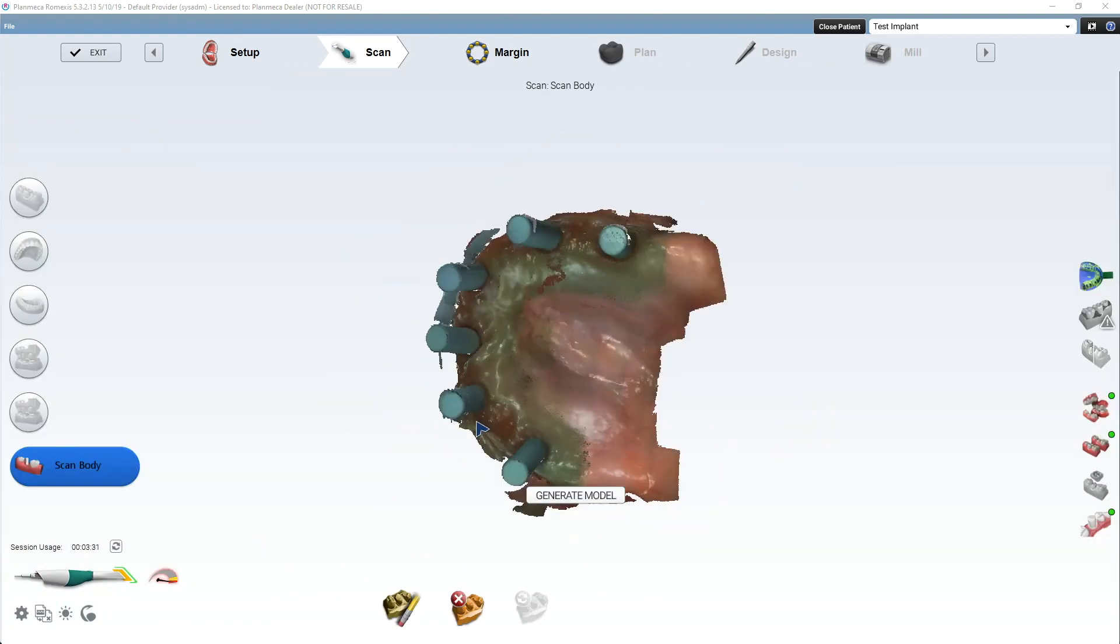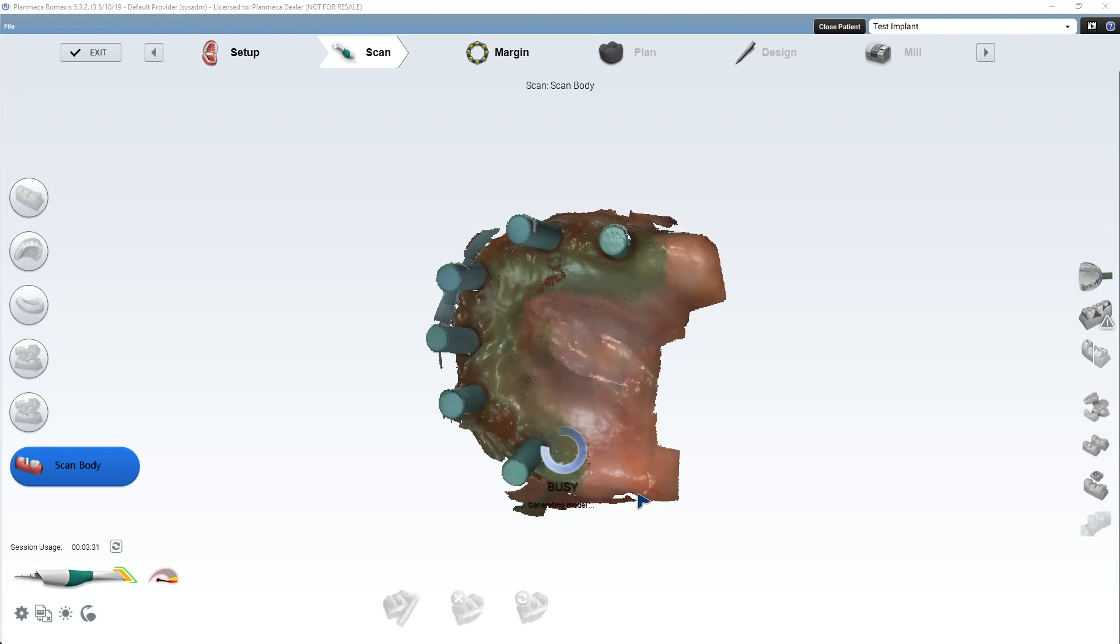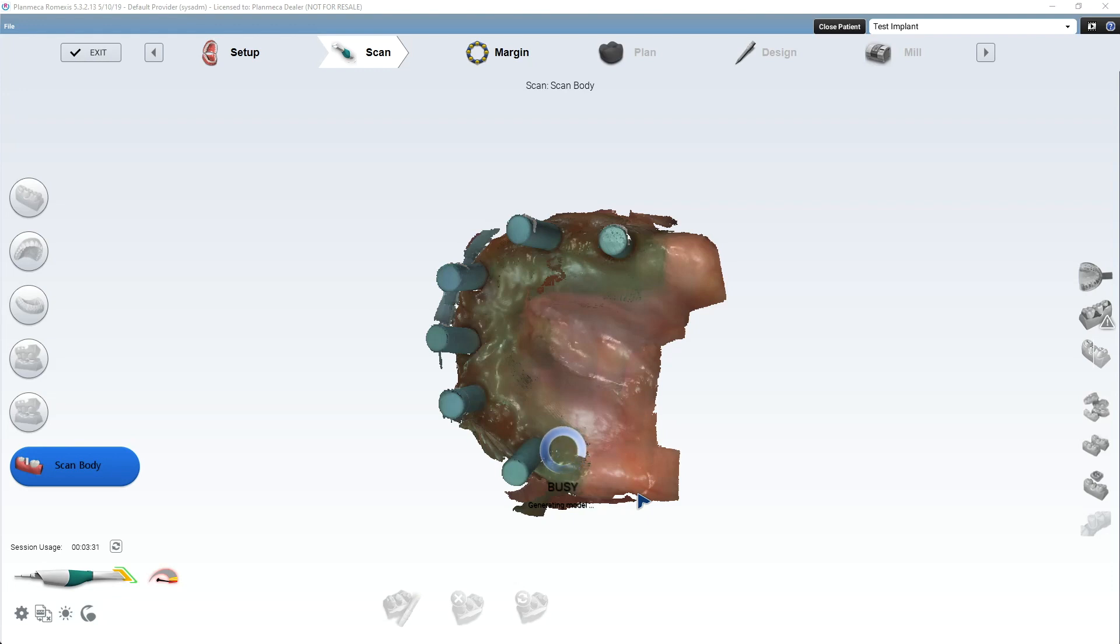So now everything's aligned. That scan body scan is aligned to the upper scan, which is aligned to the soft tissue scan, which is all aligned to the bite and space. So everything is kind of together. So I'll show you what I mean.